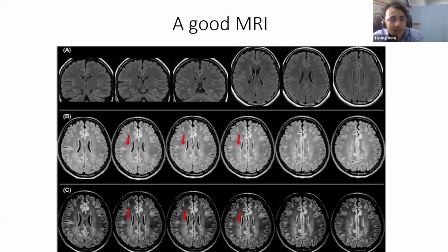What is a good MRI? A good MRI depends on multiple factors. We have to tell the technician what we want. The image on top, A, is the MRI, and B and C are the MRI of the same patient done with different Tesla or with different protocols. So in image A, we are not able to see the dysplasia, but in image B, we are able to see a little bit of the dysplasia, and in image C, we're seeing it so nicely. The dysplasia is the tract that is running from the ventricle towards the depth of the sulcus.